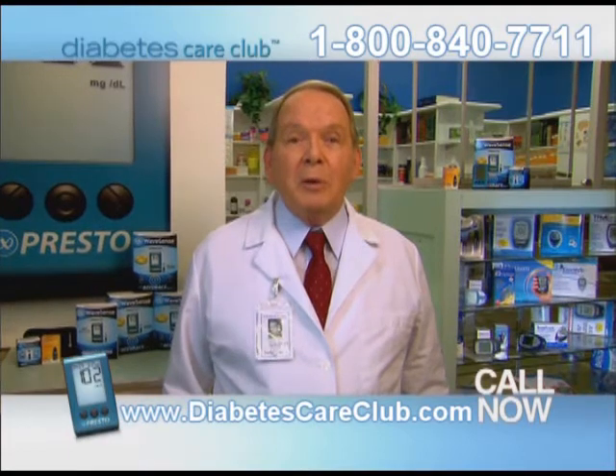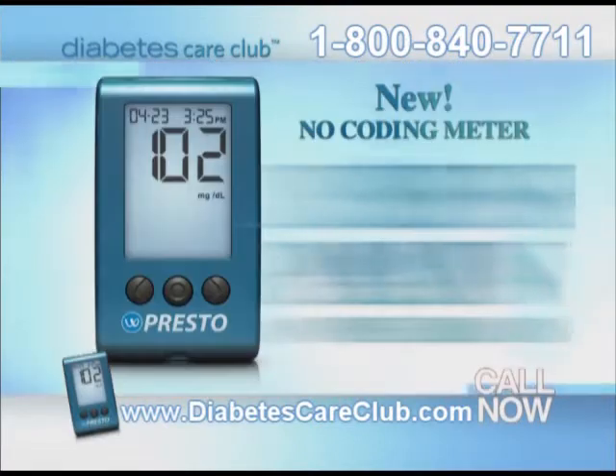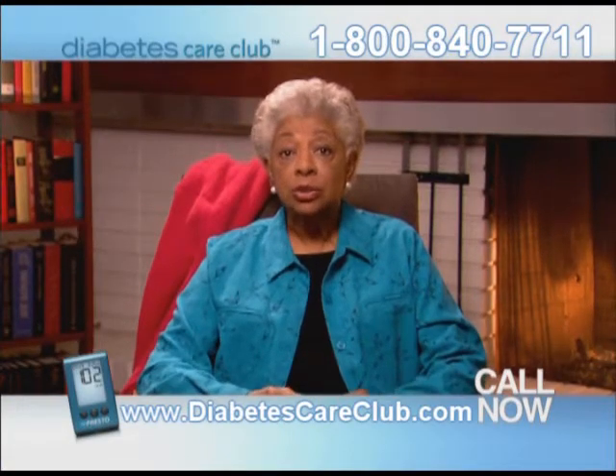If you're on Medicare with diabetes, then you need to know about the newest methods in checking your blood glucose. You don't have to code your meter anymore, and you don't have to stab your fingers. These new no-code meters are easier to use and nearly painless. This new method hurts less, and I don't have to code the test strips anymore.